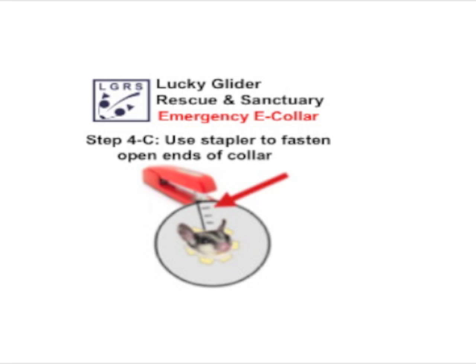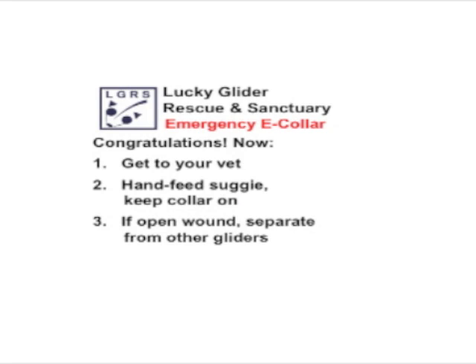Clearly, if you have someone who can help you with this it's a lot easier having four hands than two. But again, this is an emergency procedure, so you just do the best you can. Congratulations — looks like you've done it! Remember, you've got to get to your vet. This is only an emergency e-collar. When you get to the veterinarian, they'll probably have a better e-collar — a lot of times they use avian e-collars for sugar gliders. But don't leave the vet until you've tried that new e-collar on, as some have little snaps and can be either too tight or too loose. That's why the stapler suggestion is a pretty good one because you can get it just right.